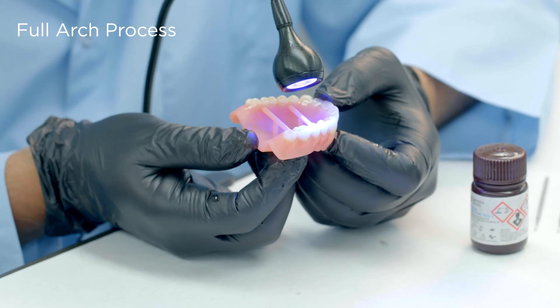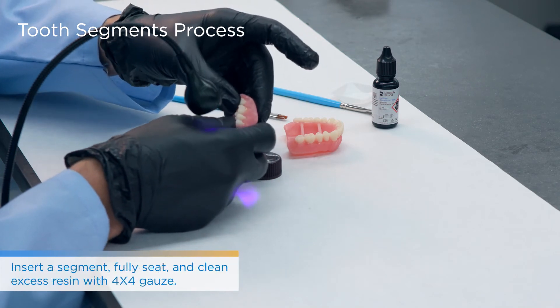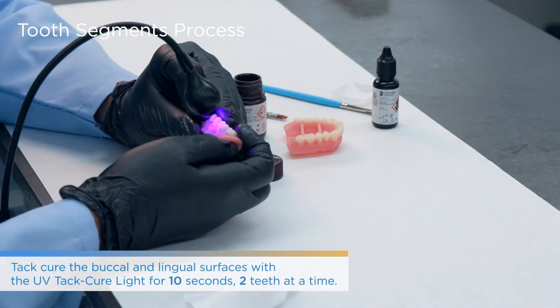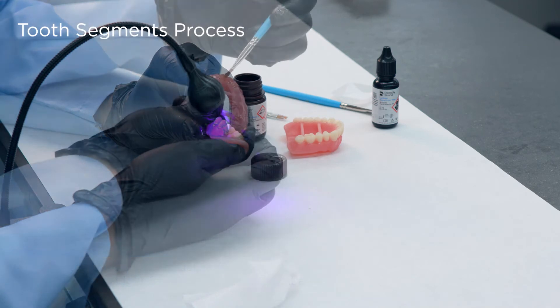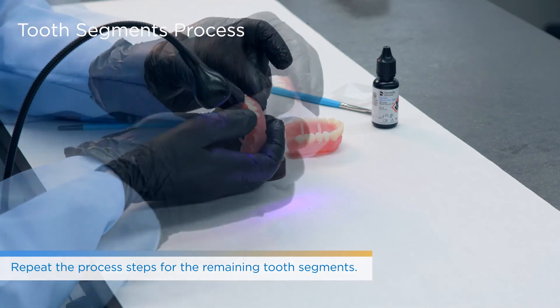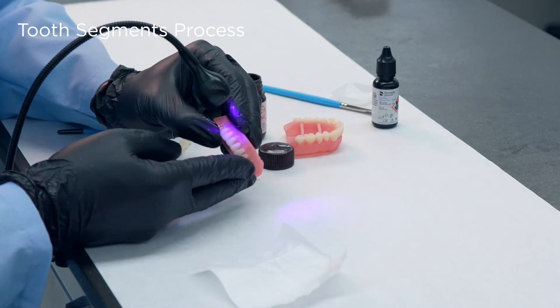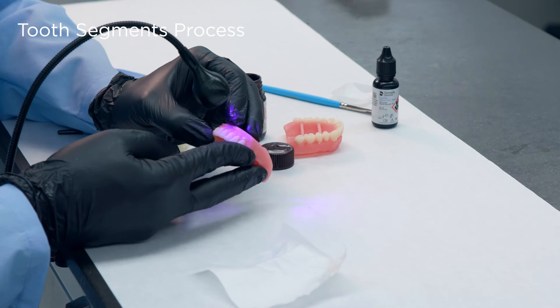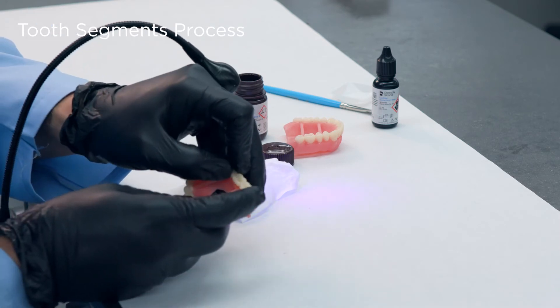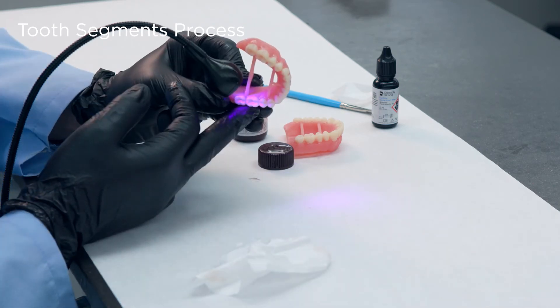For quadrant work, do it quadrant by quadrant — ideally you do not want to do the full arch all at once. If doing segments, take it segment by segment. This is mainly to better control the seating and the tack-cure process. Once tack curing is complete, go in with Fuse Step 3. On the cervical area around the margins, use your micro brush to seal off with the denture sealer.